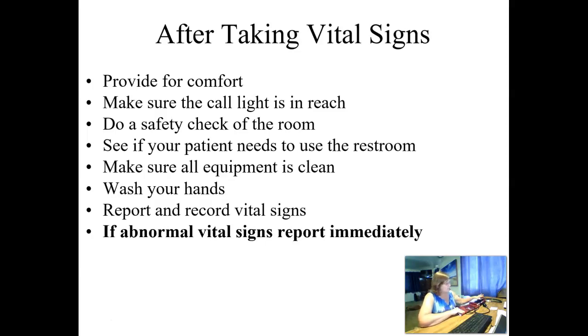I'll just take a sani wipe and wipe down my blood pressure cuff, or I'll take some sanitizer on a paper towel, wipe my blood pressure cuff so it can be drying between them and, you know, the next patient. The alcohol on them dries pretty quickly, but still it is going to get a little bit damp, so you might want to consider doing that.